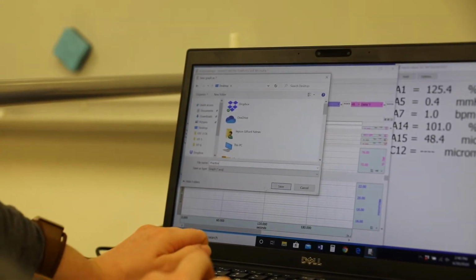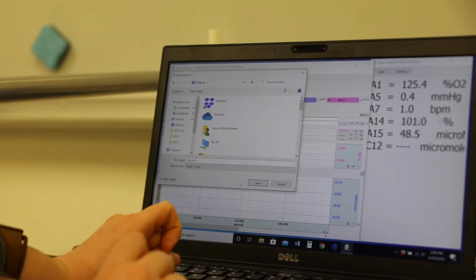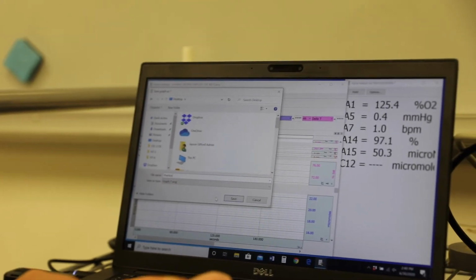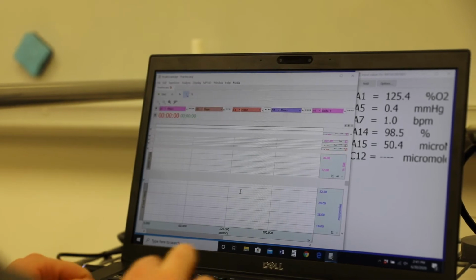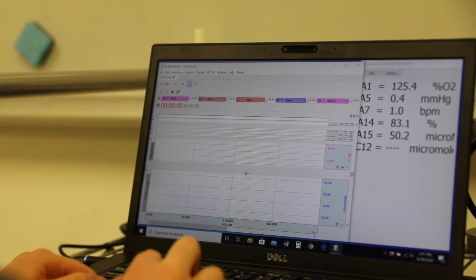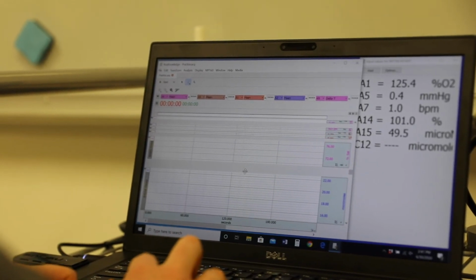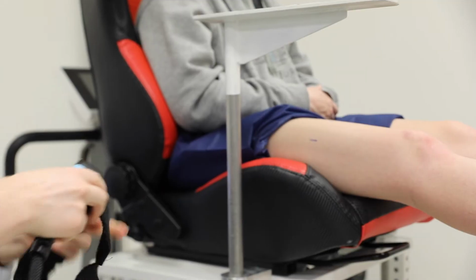So once you've typed in the name of it and the date and what this data actually is, for this we want to make sure to include in the name that this is NIRS data, not PLM data. And you'll click Save. And this will be just as is because we haven't started anything yet. So we'll want to get the probe onto the subject now.